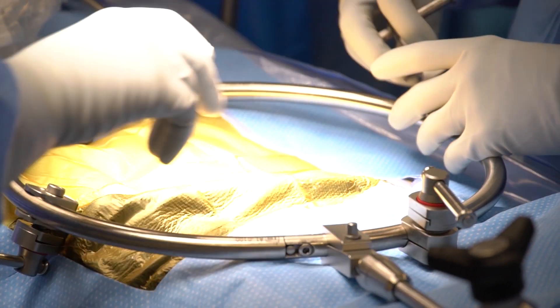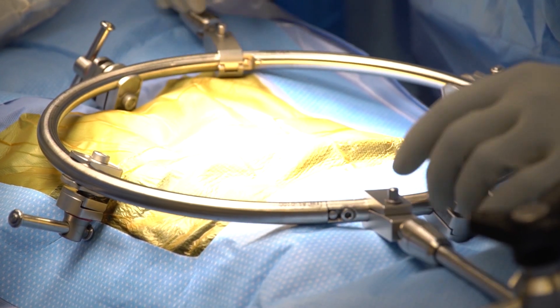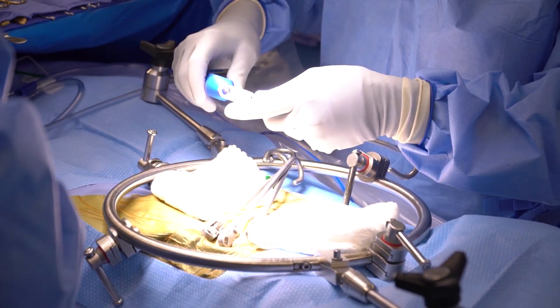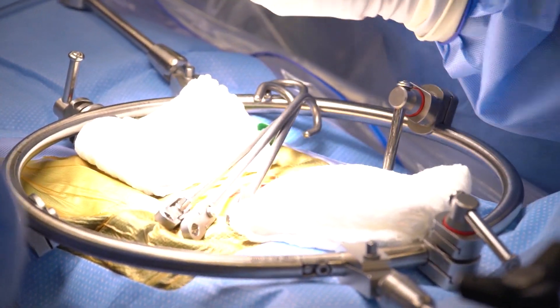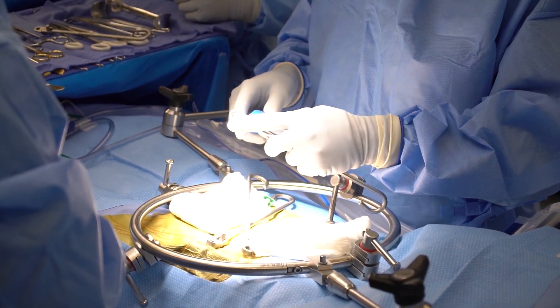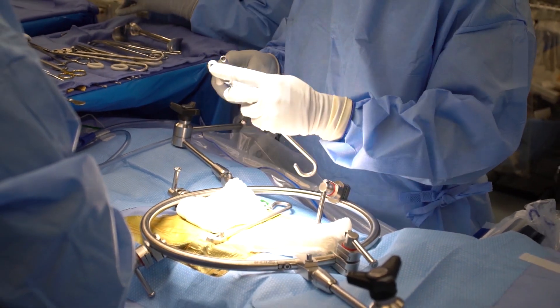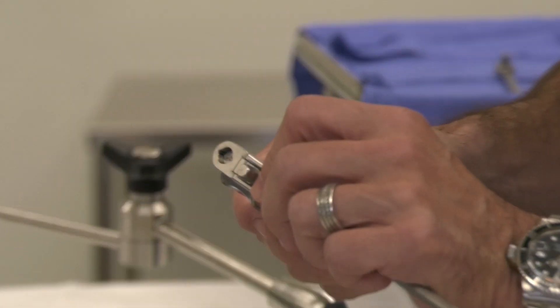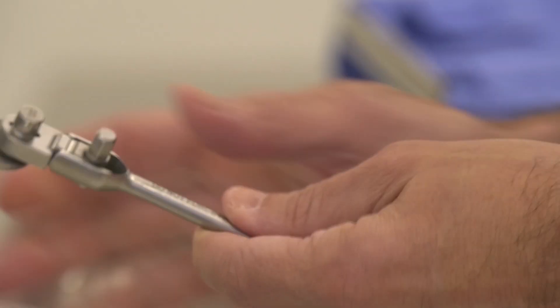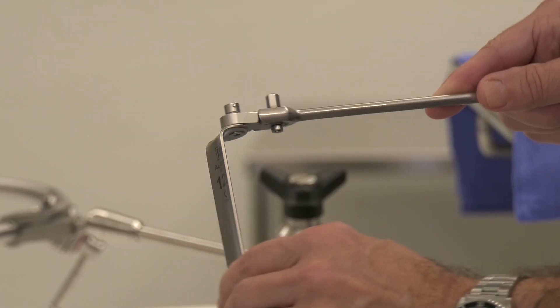Usually we'll place four of these blade holders. Once you've done your exposure and you start utilizing the retractor, I like to tighten these slightly before we start the operation. You just want it tightened a little bit more rigid so that when you place your retractor blade in, you have an option to at least change the angle without losing the angle completely.